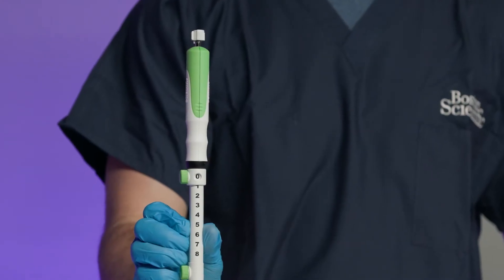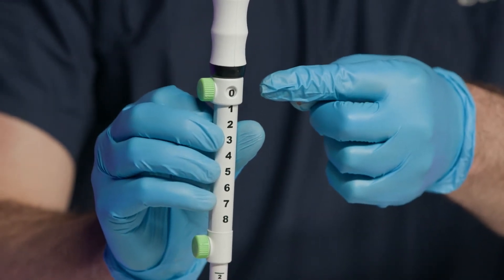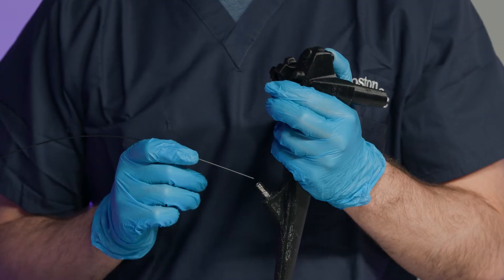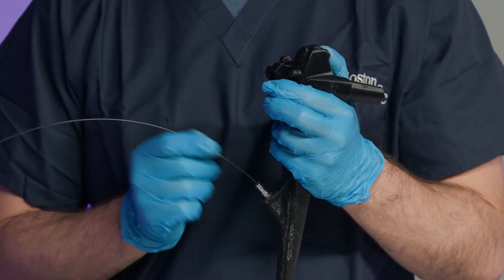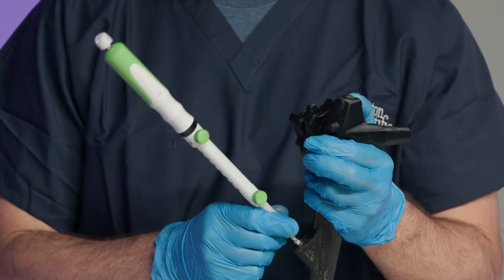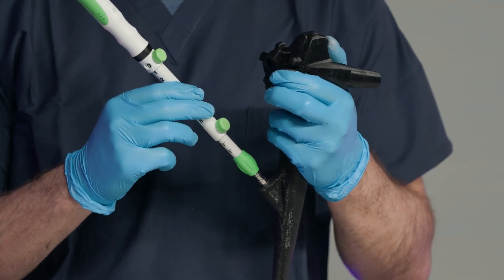To prepare the needle for use, confirm the needle is fully retracted and that the needle adjustment lock is secure in the zero position. Turn the echoendoscope elevator control knob to lower the elevator and remove the biopsy cap from the working channel. Introduce the catheter into the echoendoscope working channel and slowly advance the device until the lure attachment meets the working channel port. Tighten the lure attachment by turning clockwise to attach the device to the working channel.